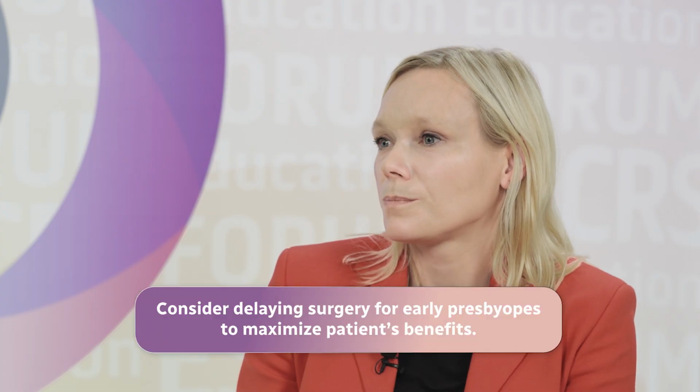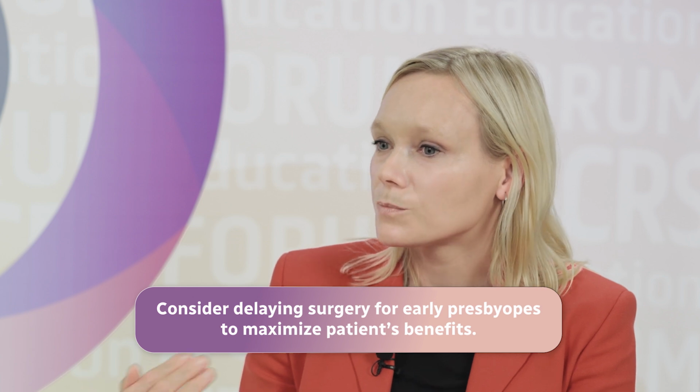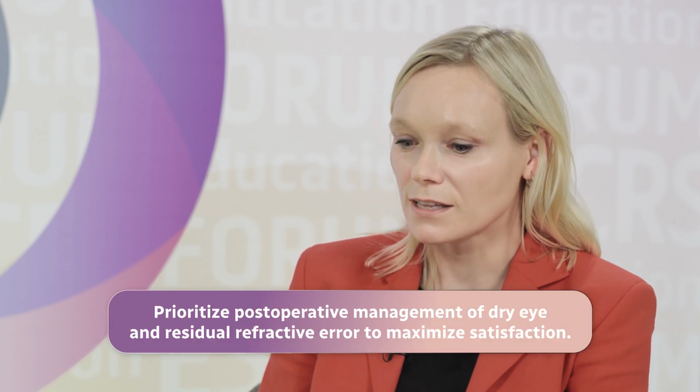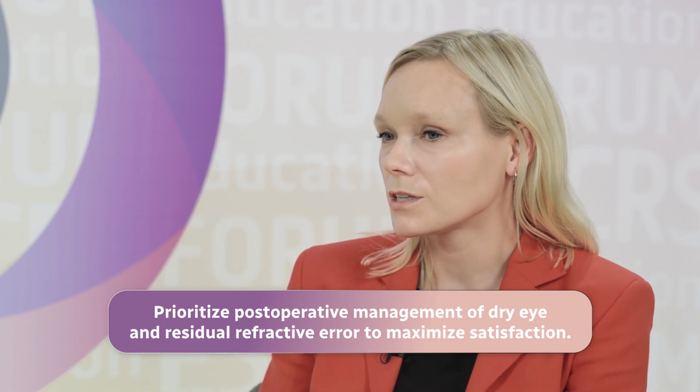And can you share a time where managing expectations turned potential dissatisfaction into a success? When it's very early presbyopia who wanted to be spectacle independent, I want to encourage the patient that we can delay the surgery until the time it will be most profitable for him. And the postoperative care is something that really matters to the patients. Managing dry eye, as we discussed earlier, can really increase patient satisfaction and their daily life. And also, if there is some refractive error, it's really good to manage it.